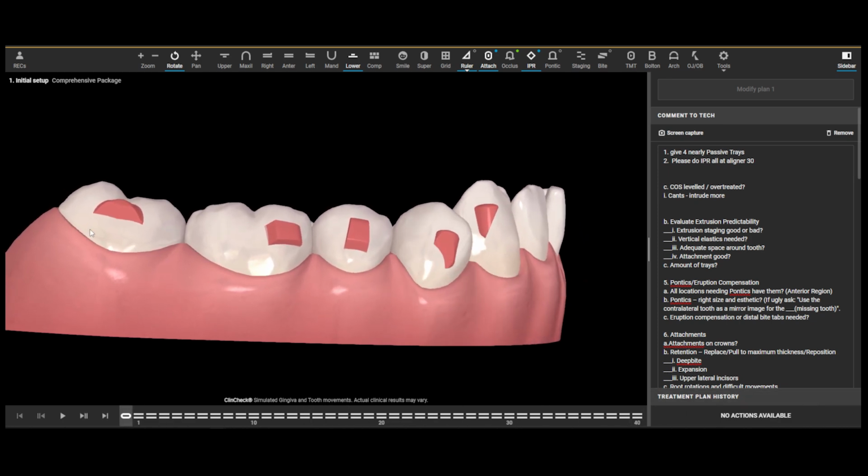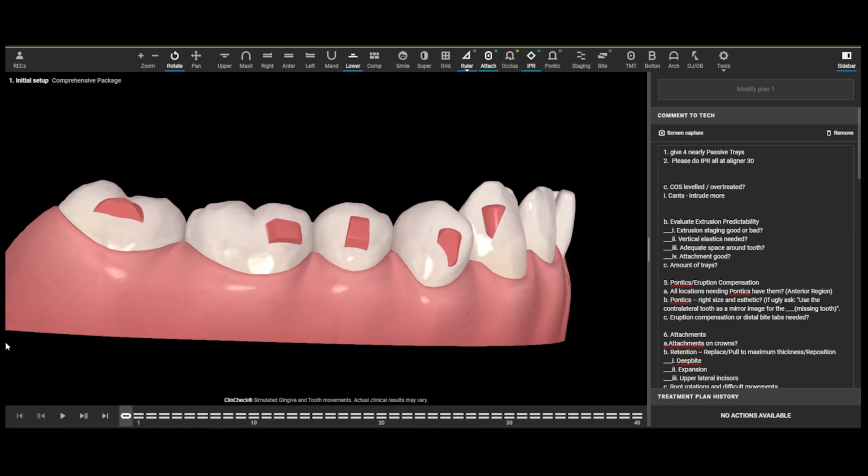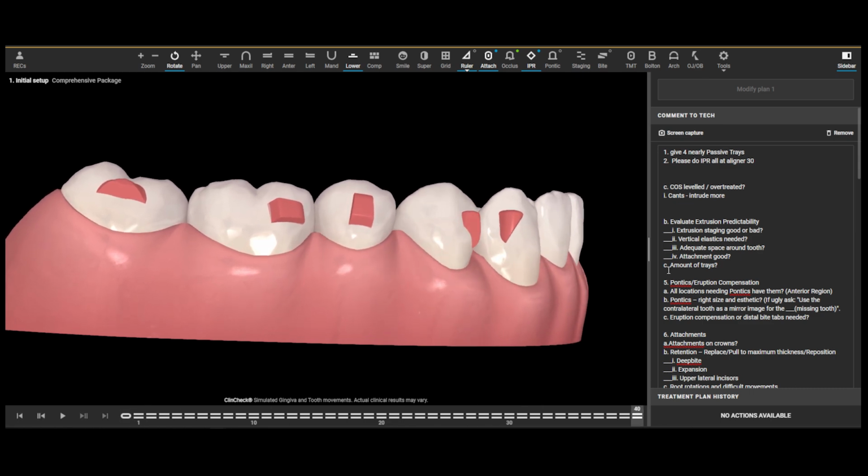And they each have big boy roots on them. 2 roots on the molars, single roots on the premolars that aren't short. That's a lot of root to move. So are we going to be able to do this alone with aligners? You already know the answer. Absolutely not. So do we need to consider using something else to help them extrude? Well, yeah. What's that going to be? Well, let's go through our checklist.